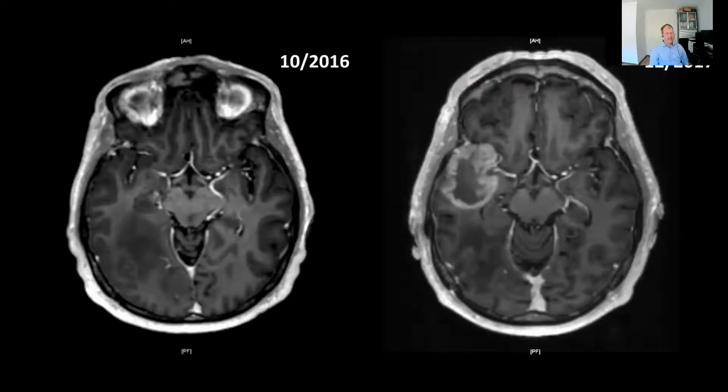But you also see this on the methylation profile. And this is what happened to the patient at the time. One didn't really intervene. This was really in the beginning of methylation diagnostics. And one said, well, we don't know what to do here clinically. So we wait, and this is what happened. So the full-blown picture of a glioblastoma is there. And we have seen by now many of these cases. And now things start changing, and oncologists start treating these patients in advance.